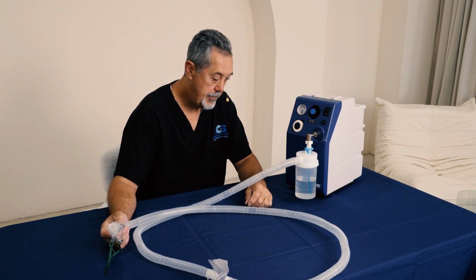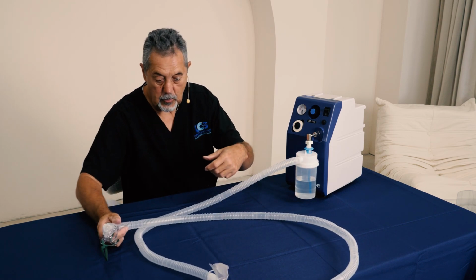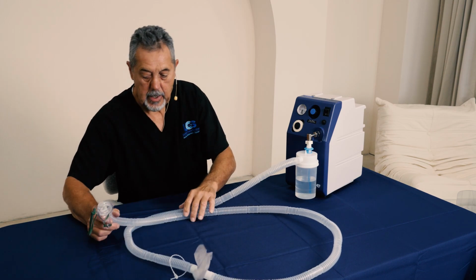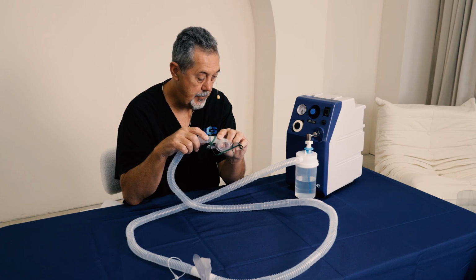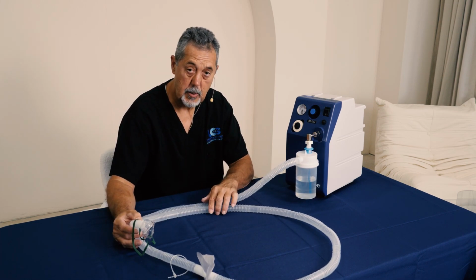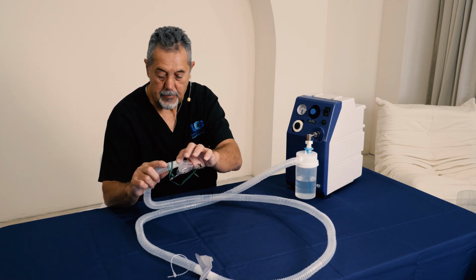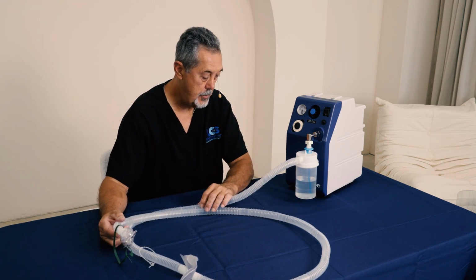Okay, so again, you want to replace your corrugated tubing once a week. You want to replace your drain bag once a week. And you want to replace your mask on a weekly basis as well. You should have plenty of supplies sent to you on a monthly basis, at least if you're dealing with our company. We provide you with 4 masks, 4 drain bags, and 100 foot of the corrugated tubing.